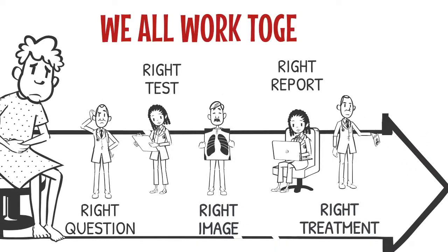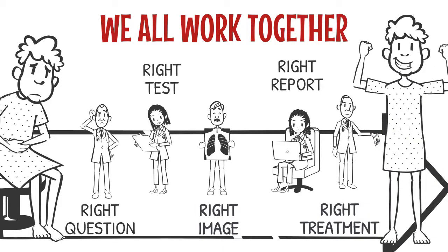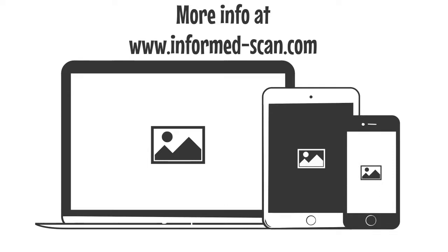Whilst the radiographers are highly trained, another member of staff reports on the images. Therefore, they will not be able to provide you with any indication of the results at the time of the appointment. A report will be provided to your referring doctor following the exam. The hospital will provide you with information on their specific requirements. Further information on radiation risk can be found in this leaflet or on this website.